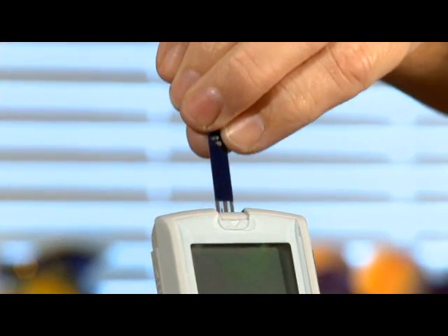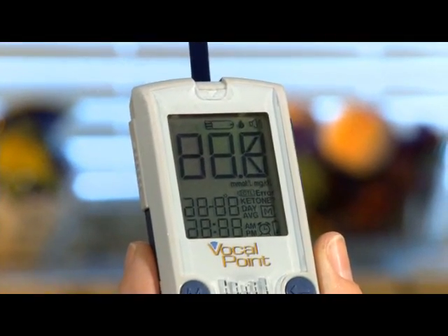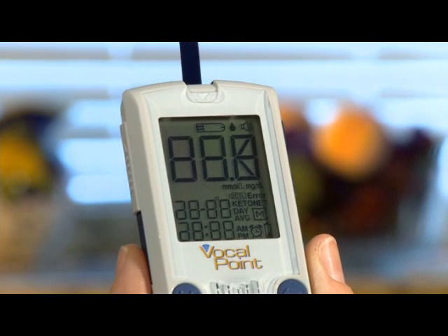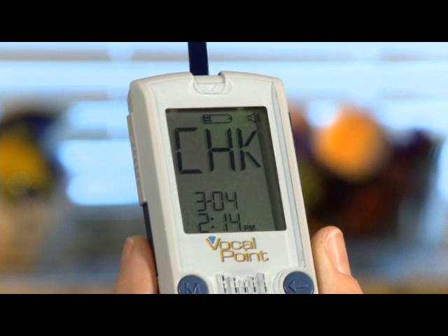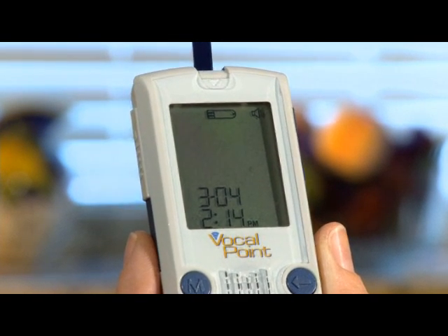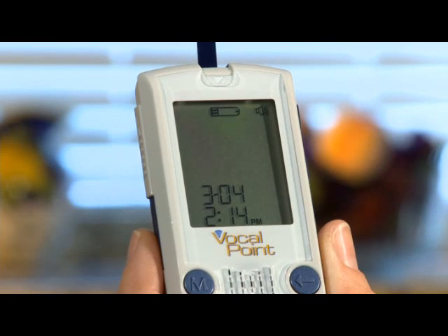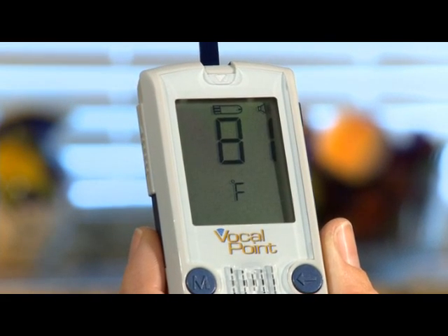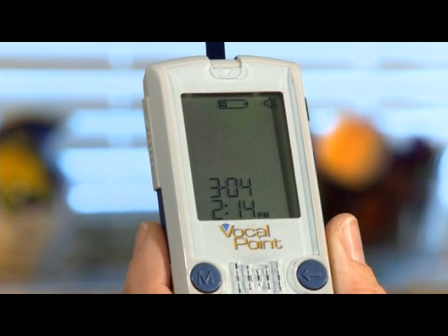Load a new test strip into the meter with the black side facing up. This will turn on the meter, displaying the letters CHK, a temperature reading, and a flashing drop alongside a picture of a strip.